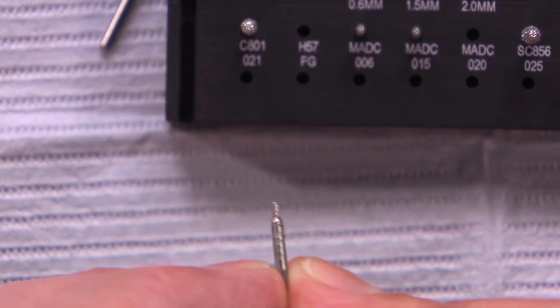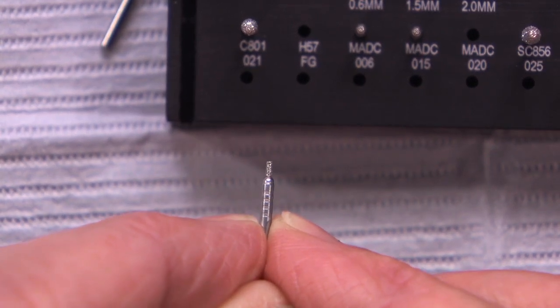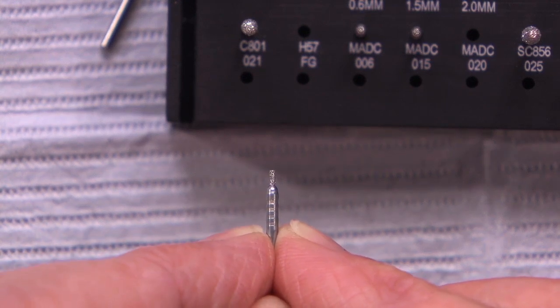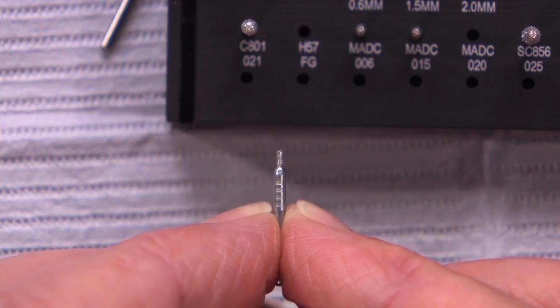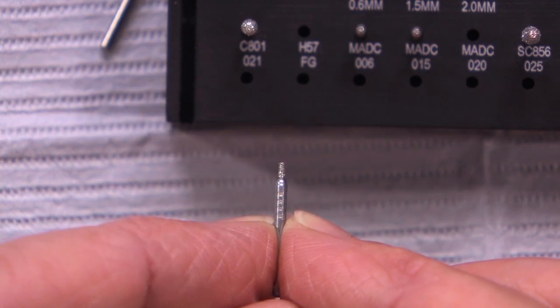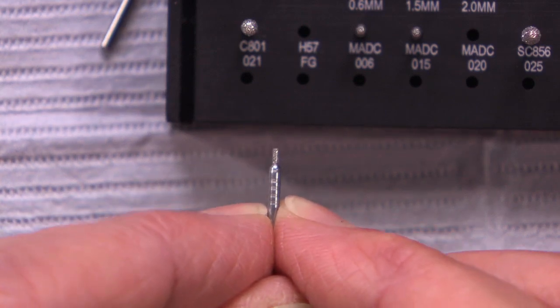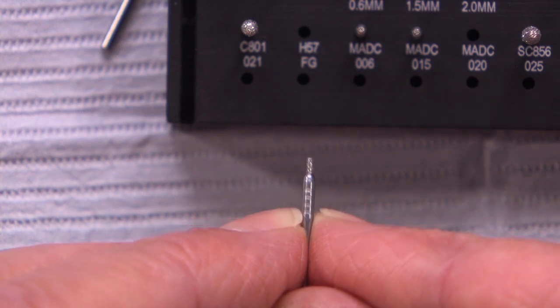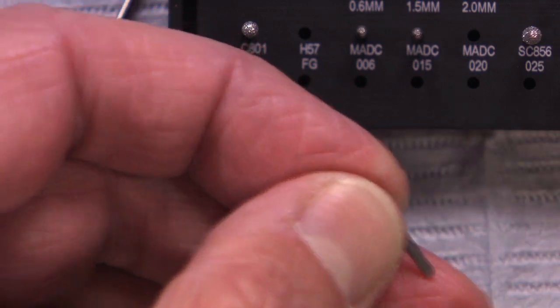It's got four rings on it. 1, 2, 3, 4. And 2 millimeters is what pretty much every dental manufacturer has been asking for in terms of occlusal reduction for a PFM for the last 40 years. You can get away with 1.5 on PFMs or on Emax, but for those cases where you want to make sure you've got the material at its maximum strength, 2 millimeters does really good. At 3 millimeters, a lot of materials, including traditional ceramics, actually get weaker. So 2 millimeters is where a lot of these materials, especially the feldspathic ceramics, reach their maximum strength.